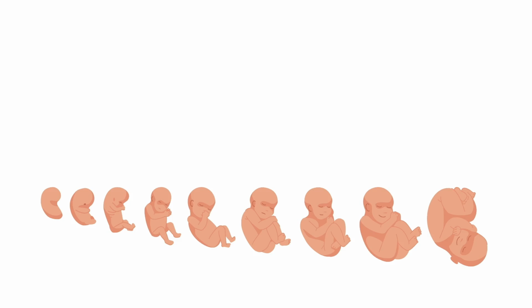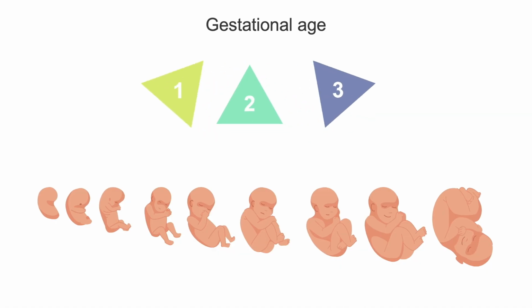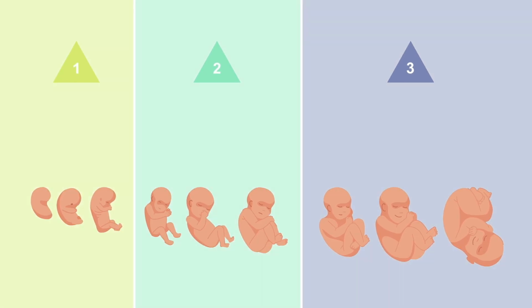Once you've identified a definitive IUP, you can further assess for gestational age by ultrasound. There are a few different techniques you can use. This will depend on the estimated gestational age. Early in pregnancy, in the first trimester, you will determine the gestational age using the Crown-Rump length.